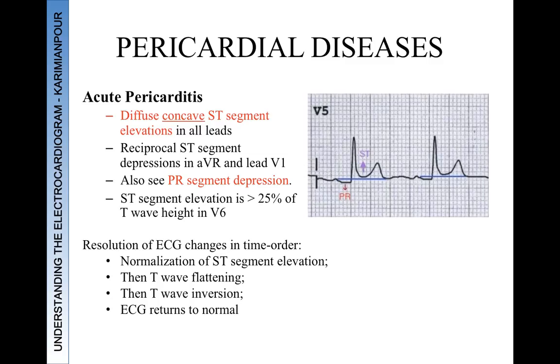That's important to recognize, because a patient being treated as an outpatient for pericarditis may come back with chest pain, and a repeat EKG shows T-wave inversions. It may not be that they're having ischemia, but it's just the normal resolution of the ECG changes.